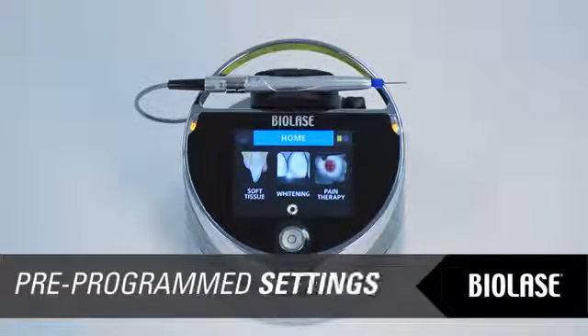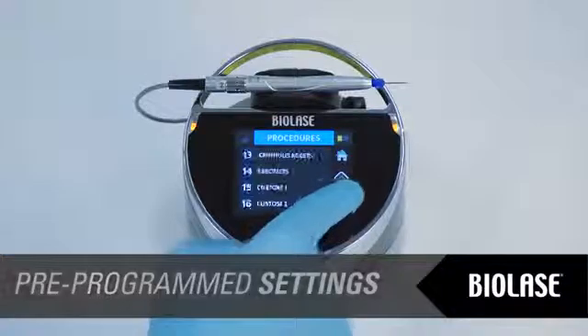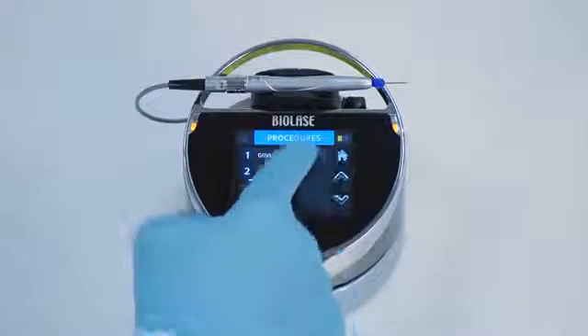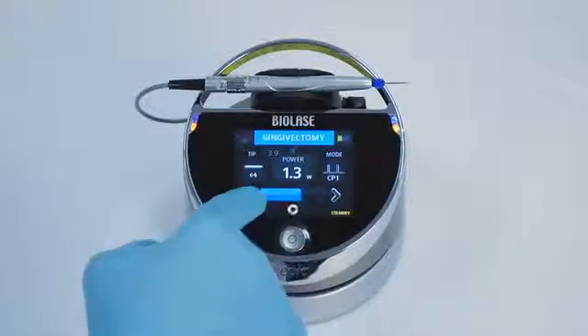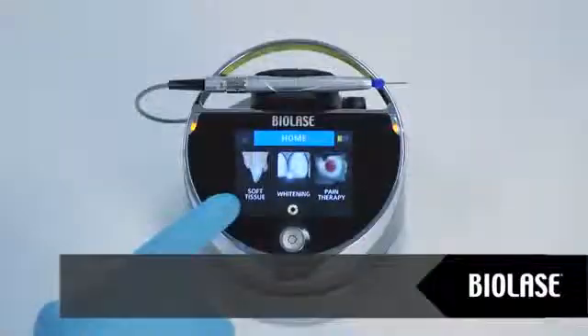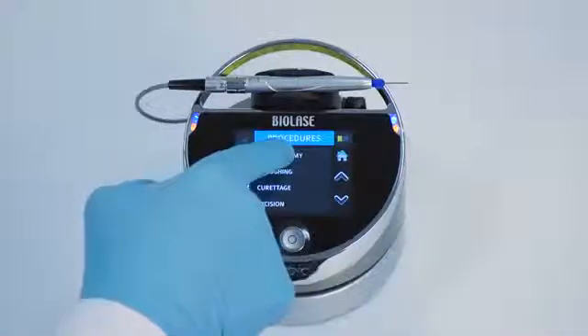The EPIC has the ability to store up to 20 preset procedures for soft tissue surgery. It is factory installed with 14 pre-programmed procedural presets and 6 empty slots for custom presets. To select a procedure preset, scroll through the list and tap the procedure you wish to use. To store your personal preferred setting for any procedure, scroll to the procedure you wish to customize, enter the new parameters, then press and hold the procedure name for 2 seconds. You will hear a beeping sound confirming the settings are stored.